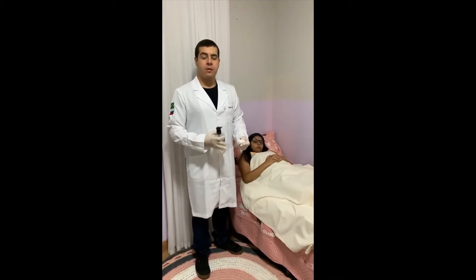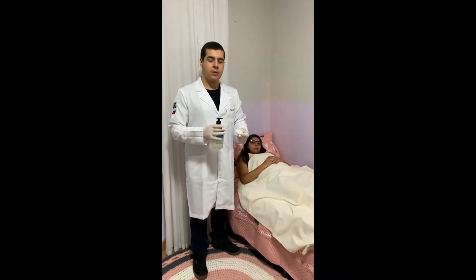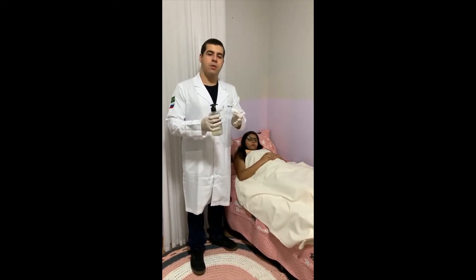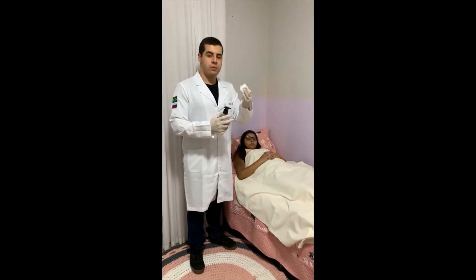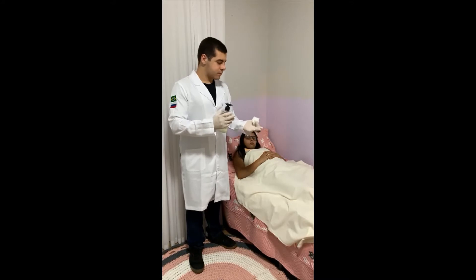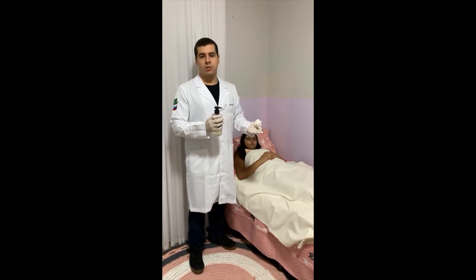For that procedure, for female, we need to open the legs of the patient, then we need to keep the labia alone and pass the cotton with the antiseptic solution through all the area, then we will keep the labia separated and put the collector in place.